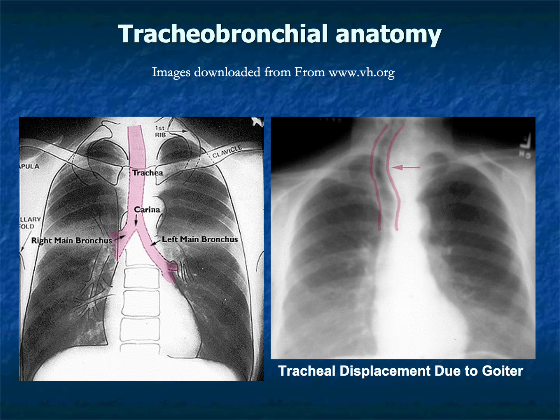The trachea may be compressed, displaced, narrowed, distorted, or rotated by thyroid enlargement, tumors, vascular abnormalities, lymphadenopathy, or prior surgery. One of the important skills in bronchoscopy is recognizing when the airway is no longer occupying its expected anatomical position. Normal orientation becomes the reference point from which abnormalities are recognized.